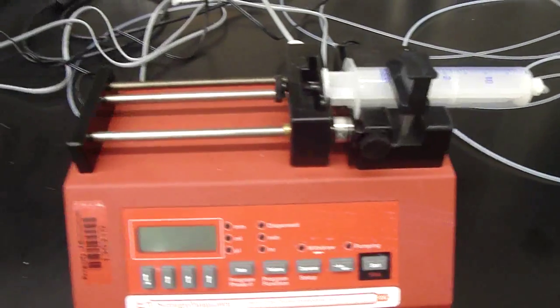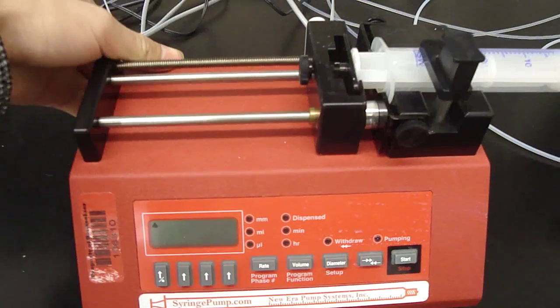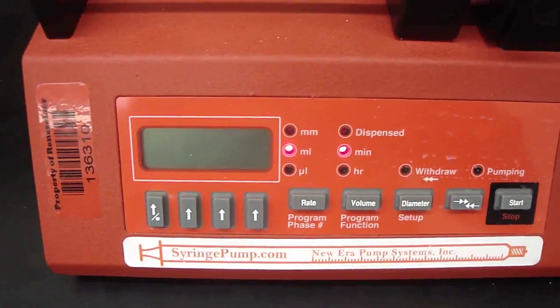In this video, I will show you how to use this syringe pump. So first, you turn it on. As you can see here, there is a display screen on the left and four arrows under it.